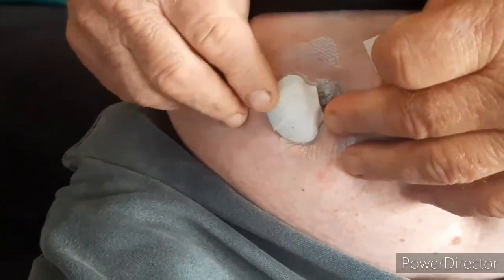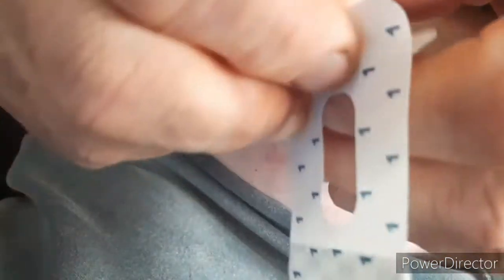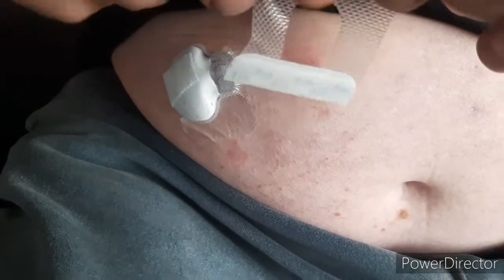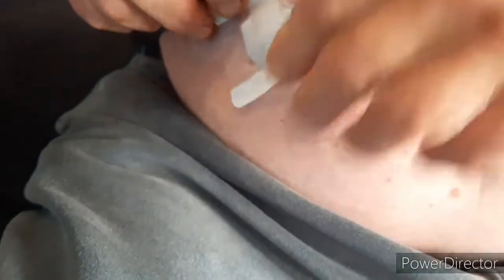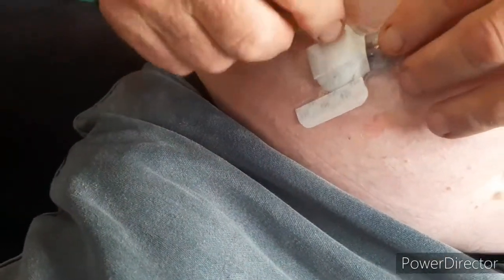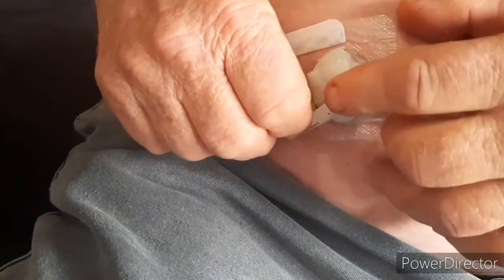With the second adhesive pad, remove the backing. It goes over both sides and over this area here, and then just in front as well. Remove the strips and press everything firmly down.